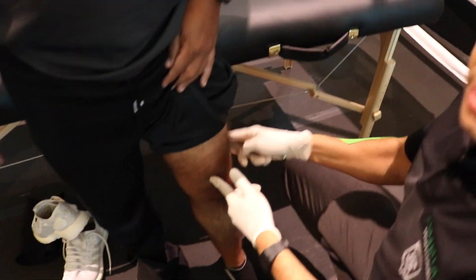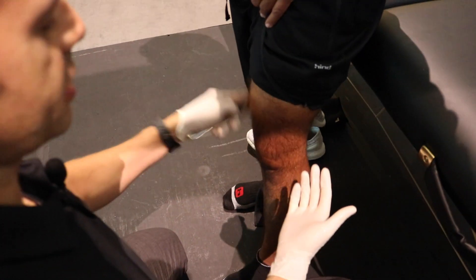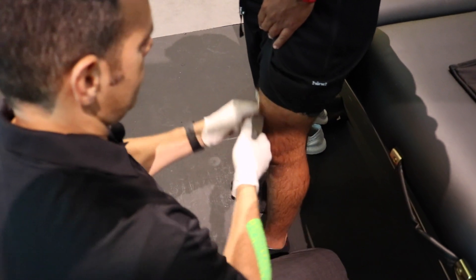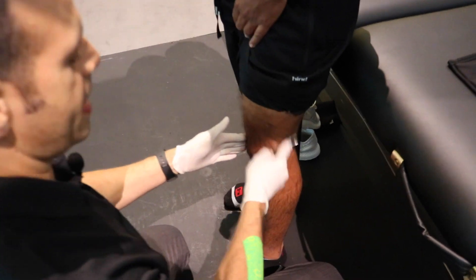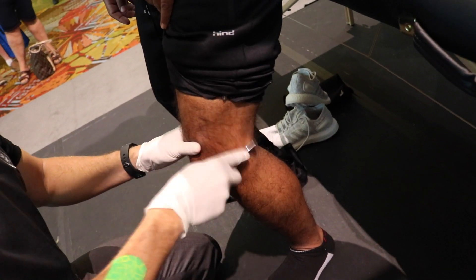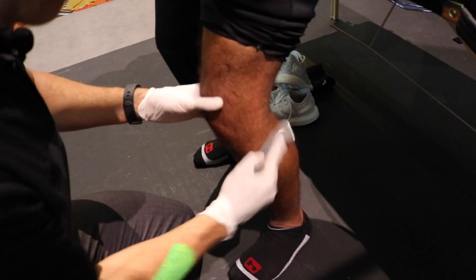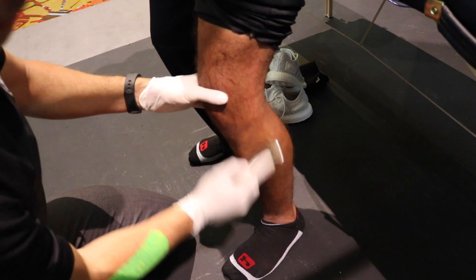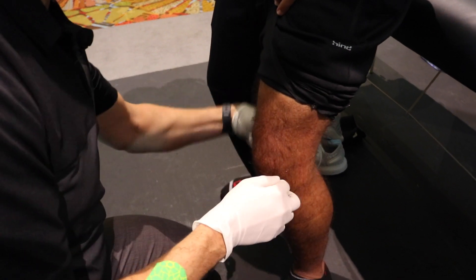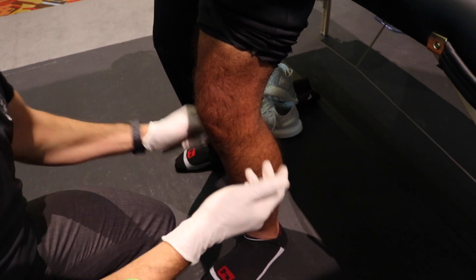We're going to be using about the weight of the instrument — nothing too aggressive. Once we get that nice red on the skin we know we've created a neurologic stimulation because of the vasodilation that's happened on the blood vessels underneath the skin, those superficial capillary beds. It only takes a couple of minutes. These patients would have had pain on squatting, so we may have the patient go a little bit into a squat to activate those tissues more. Remember, how much they're able to do is based on the function of that patient — the older or more significant the degeneration, the less they'll be squatting. Then once we finish getting that nice hyperemia on the skin, we'll get into a couple of nook-and-cranny areas also involved with this tissue.